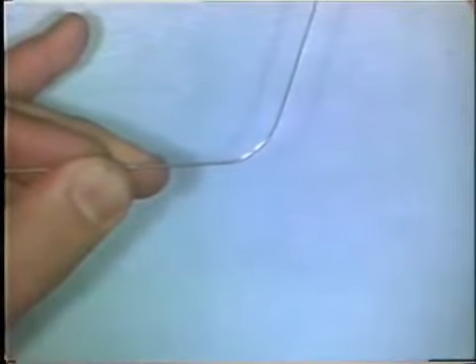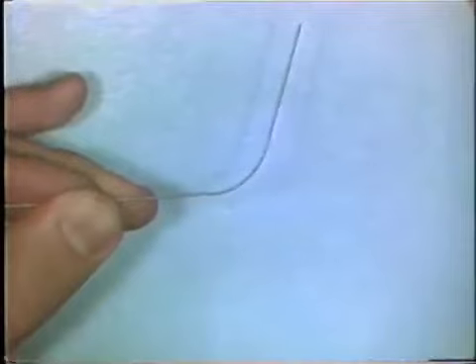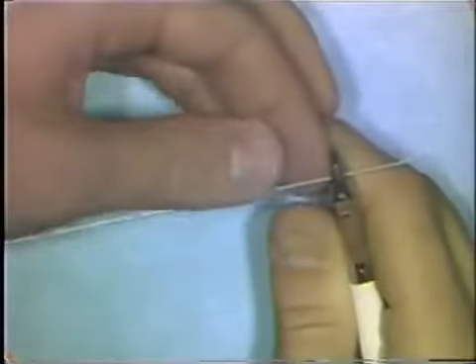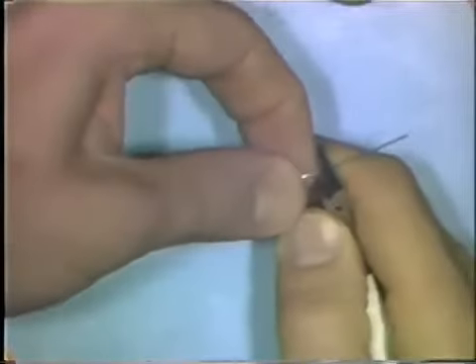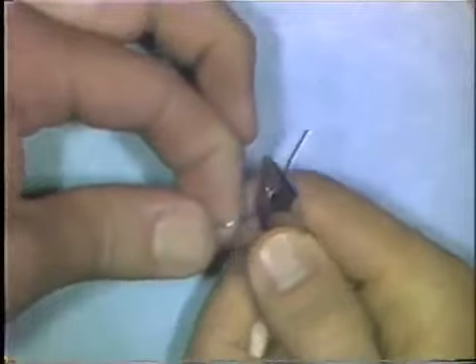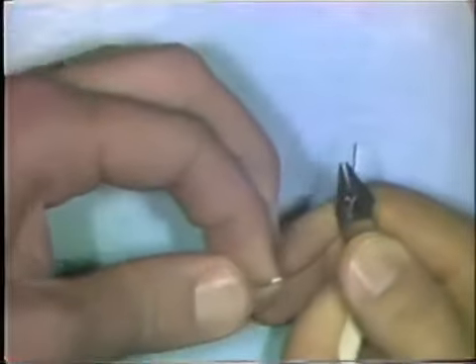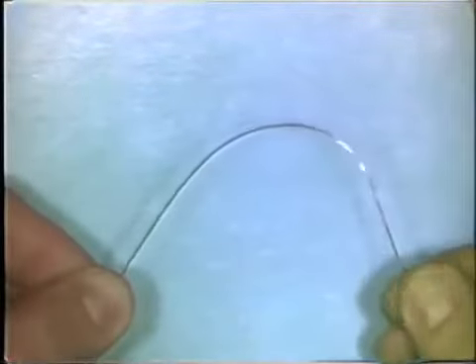There is another way to make a curve in a wire. You can do it with a whipping motion of your thumb and finger. So I'll demonstrate. You place the wire in the beaks of the plier. The plier serves as a vise to hold the wire. And using your thumb and finger, you whip the wire along your finger and smooth it like that and make a curvature.